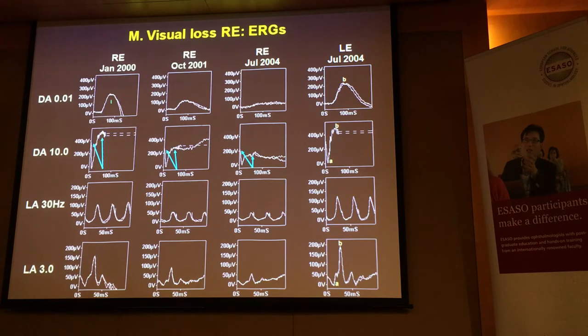But he was basically losing his ERG. He started off with a normal ERG. Then he lost a little bit of A wave, a bit more B wave. And then he continued losing B wave with less A wave. So he's got progressive inner retinal disease, also with some photoreceptor involvement. We had no idea what it was. And this poor kid was coming back and repeating our genes, repeating the gene, nobody had a clue.